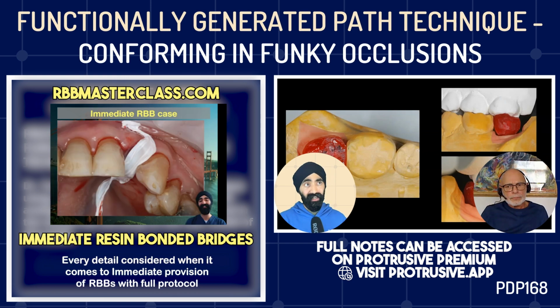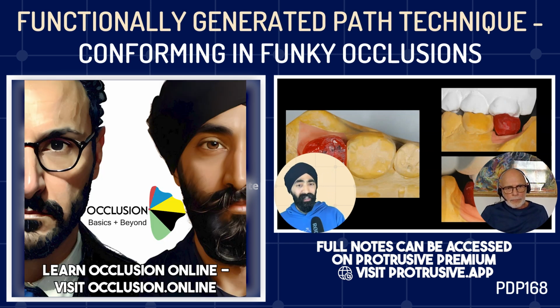So with the pre-prep scan, instead of just scanning the broken cusp, literally spend 2 minutes filling it with composite and generate the patient's functional and parafunctional pathways, and then give that information. It's going to be more valuable than the technician seeing these broken cusps in the pre-prep scan. There's no value in that, but then you're really building the value by adding that extra information in.